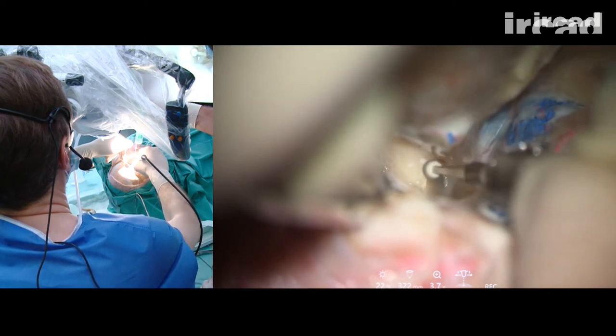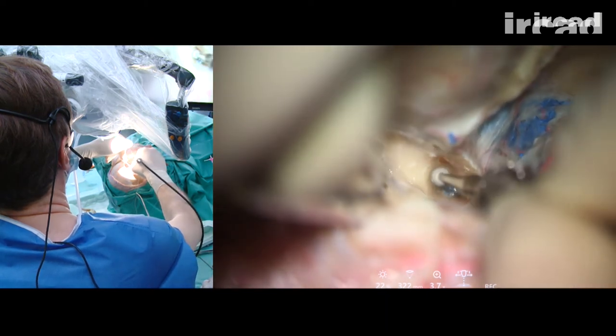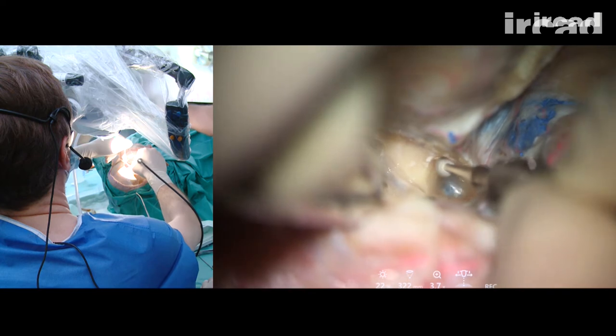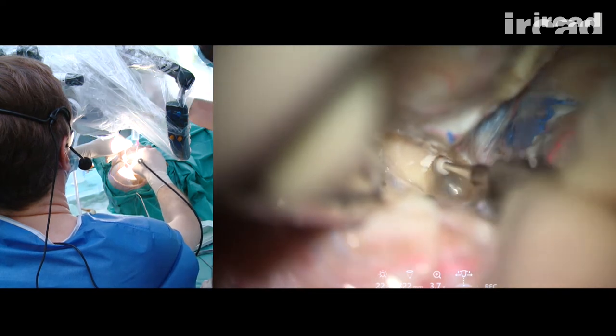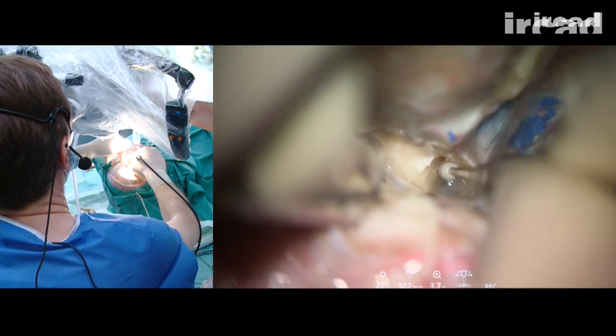I am drilling now on the lateral aspect of the optic canal towards the inferior surface of the clinoid. With the inferior surface of the clinoid, you need to be careful because just below it you have the third nerve.